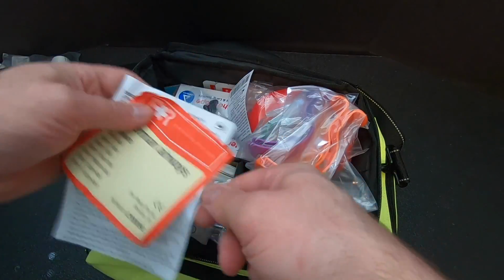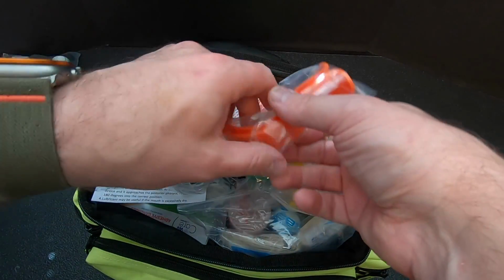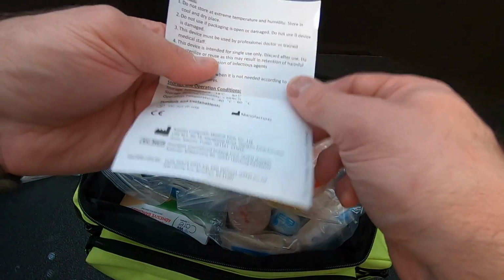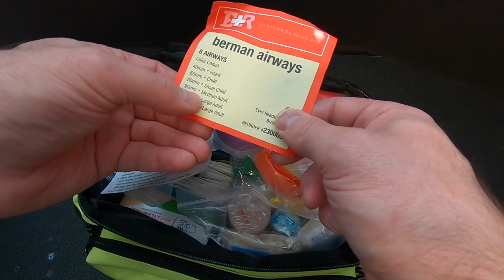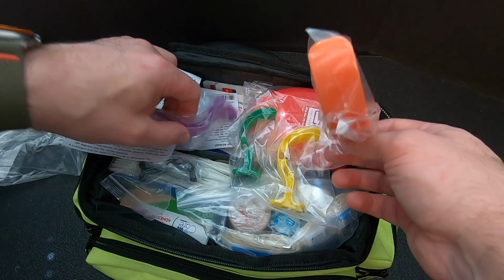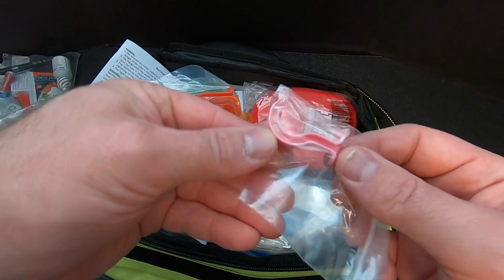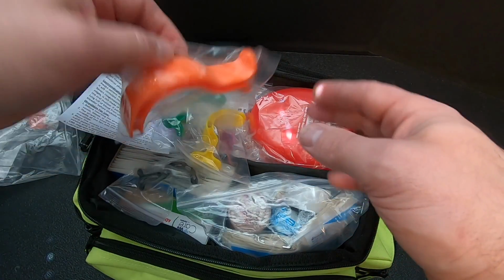Okay, so these are airway inserts to help open up the airway, and they've got different sizes for different size people. So let's see here. So 40 millimeter infant, 60 millimeter child, small child, medium adult, large adult, and extra large adult. I'm an extra large, I would imagine. So, oh, look at the little one for an infant. It's teeny tiny. That's cute. Could use it on my cat.